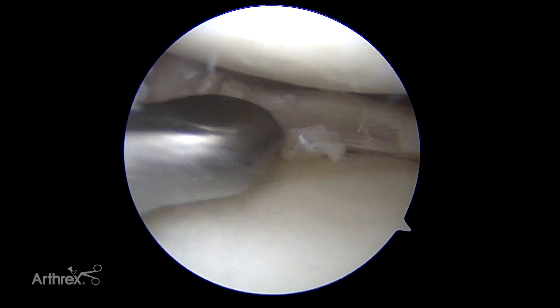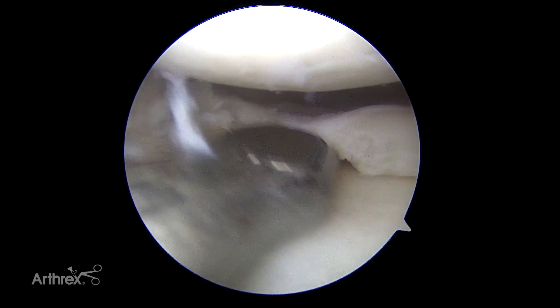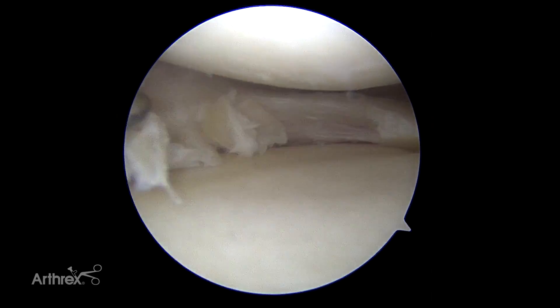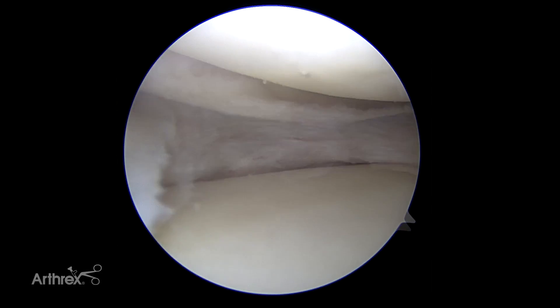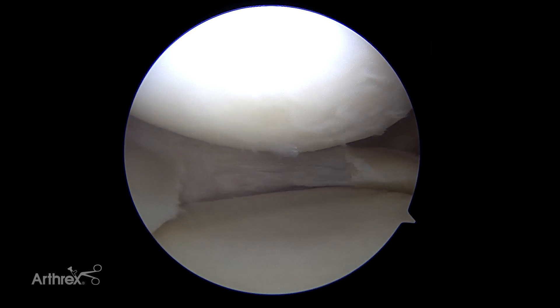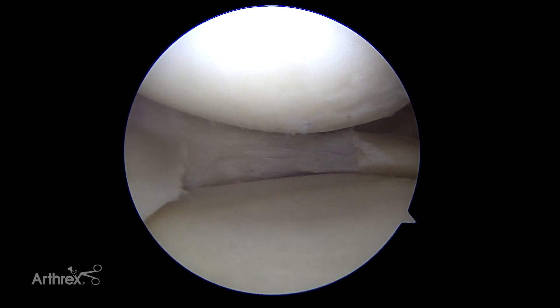I try to leave a 90-degree angle here at the back where we'll suture the segmental to the native area of the posterior horn, then up to the anterior aspect of the area of the tear. There's our preparation — we've got back about a millimeter or two of the native rim, and that's where our segmental meniscus is going to fit in.